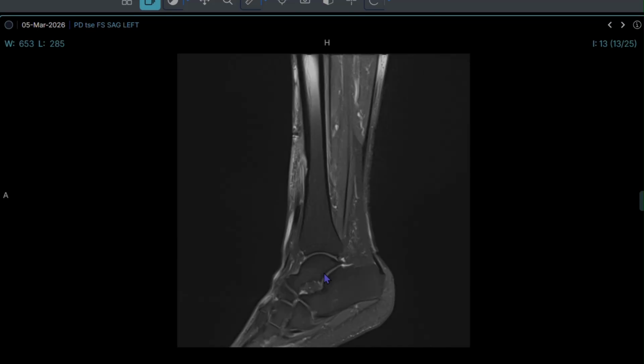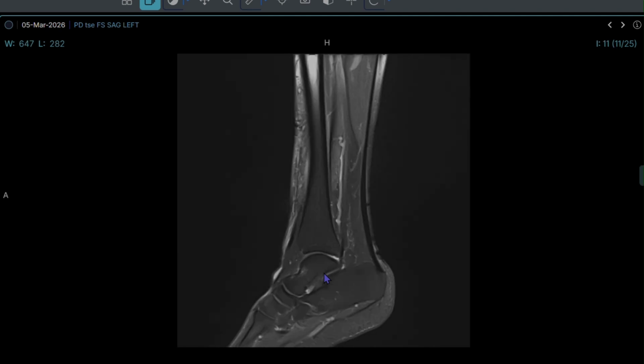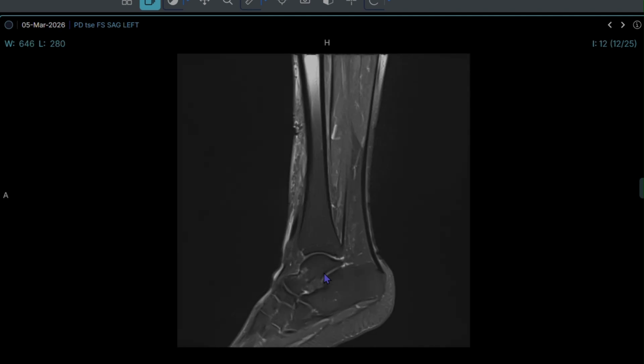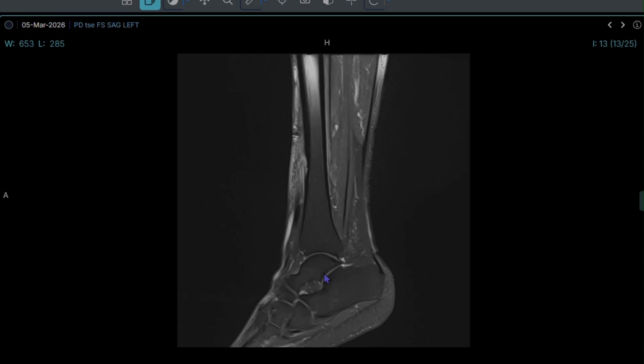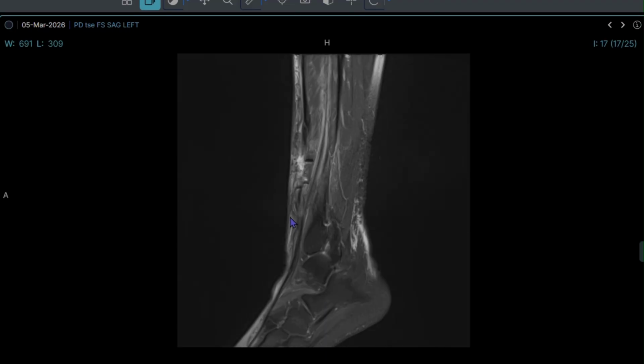This kind of cut injury commonly occurs in construction workers, and we just need to trace the anatomy, and we should be sure about tracing the entire tendons, not just the area where there is a clinical suspicion. If we try and see the anatomy carefully, we'll be easily able to trace all the tendons.